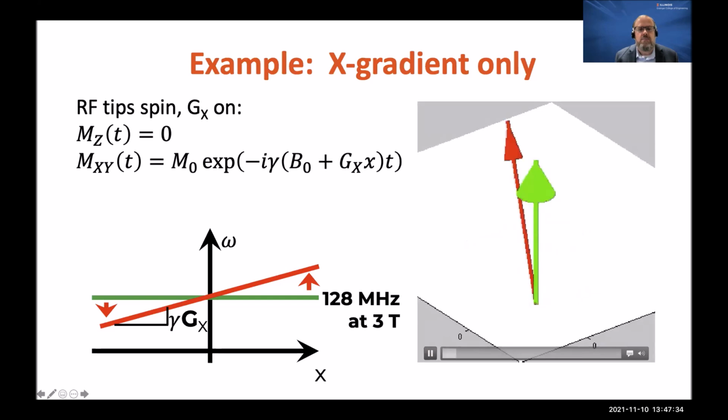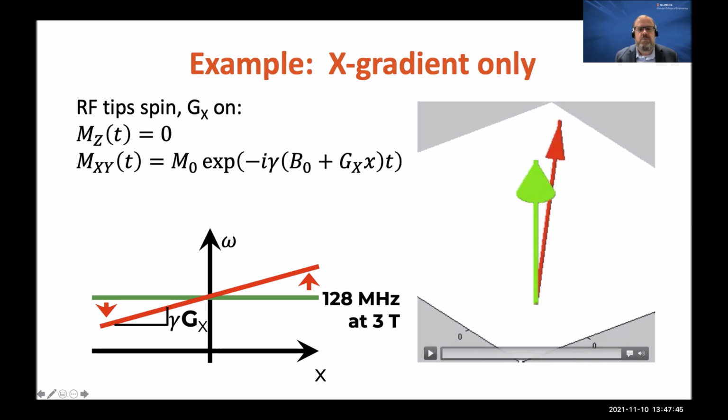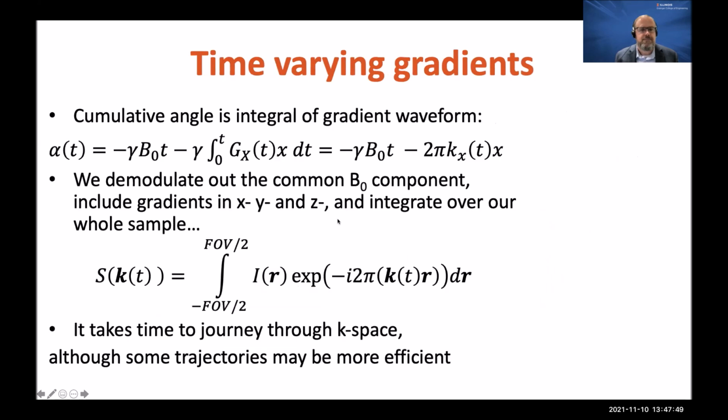And so the main magnetic field in green here and our protons in red, they're spinning around, and what we do is we put a coil next to this and we can pick up the EMF. We can pick up the magnetic field variations from those spinning protons, and that's what produces our signal. We induce currents in our coil.